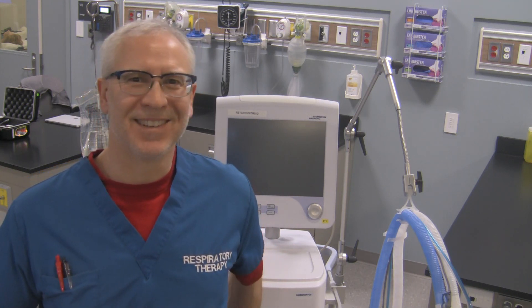Hi, I'm George. What I'd like to do today in this video is show you how to do the pre-use check on the Hamilton G5 ventilator. And it's not G for George, it's G for something else probably. Anyway, so it's the Hamilton G5 ventilator — this is a pre-use check and how to do it.